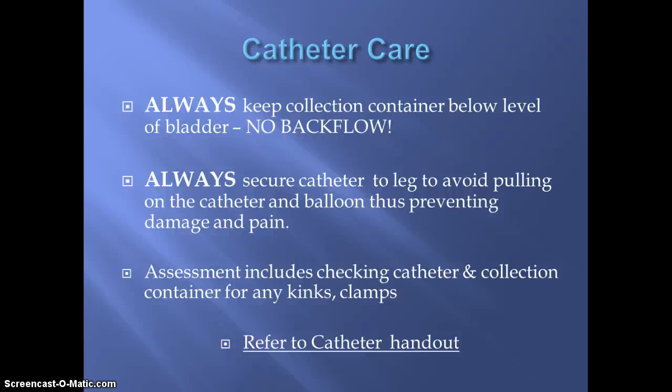Catheter care, I know you've done your videos for this, but there's a couple of things that I think are really important that I've seen in practice that I just really don't like. Always keep the collection container below the level of the bladder. You do not want backflow of urine back into that bladder, and always secure the catheter to the leg to avoid pulling and damaging the neck of the bladder and causing pain.